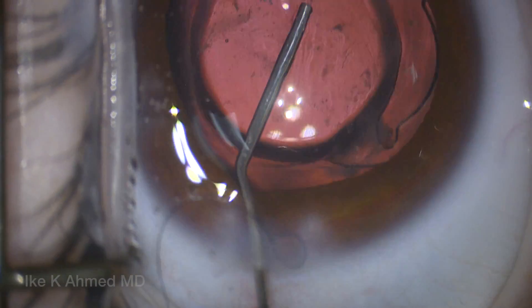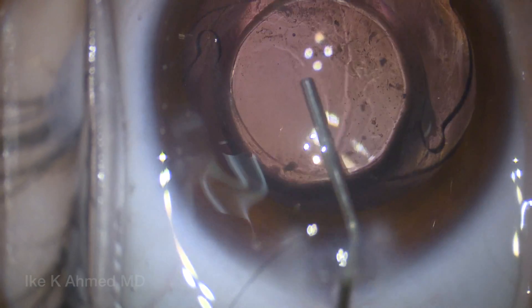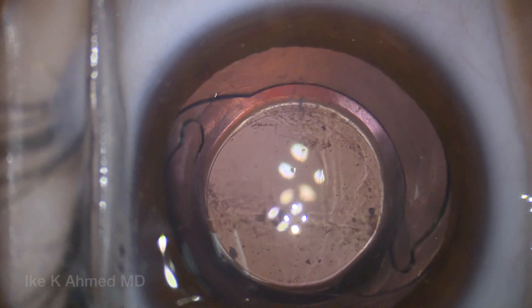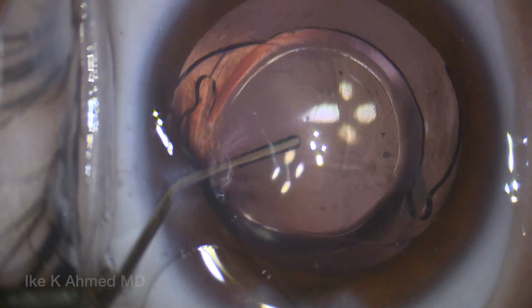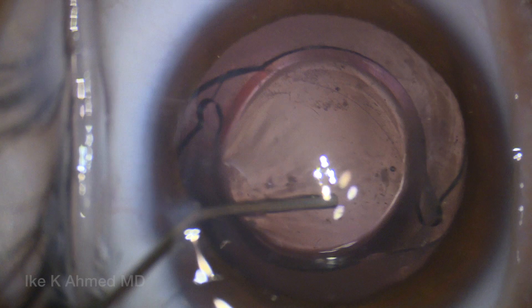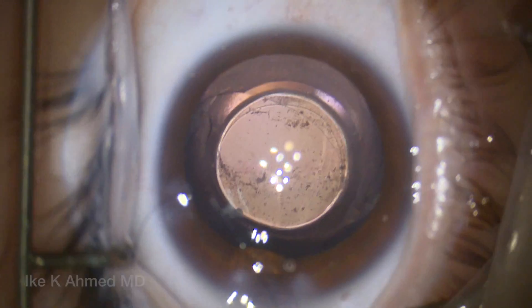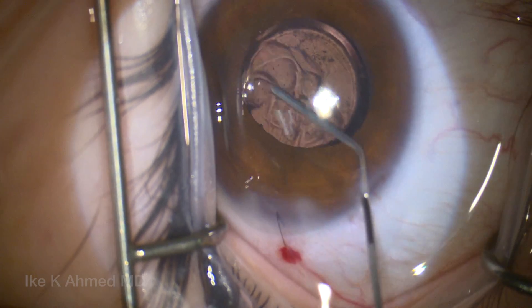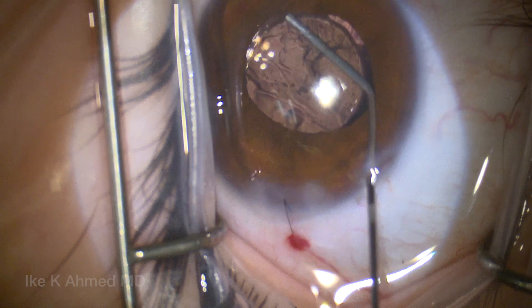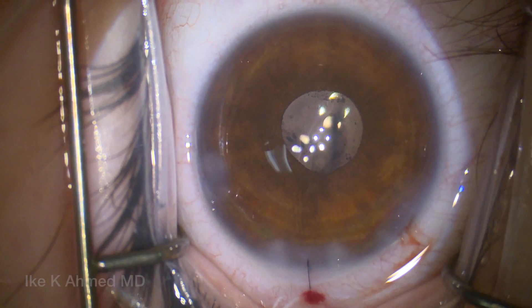We're going to prolapse the optic pole behind the posterior capsule to place that optic in a posterior optic buttonhole position. This will nicely center the lens, keep it well positioned, and keep the anterior hyaloid face away from anterior vitreous prolapse. The visual axis is quite clear, with only a few opacities present — minimal effect, very much as we might see with some asteroid hyalosis. These will dissipate over time as vitreous syneresis occurs. We've accomplished this without any vitrectomy. Note the cat's eye appearance of the posterior capsule as the haptics remain in the capsular bag while the optic sits behind the posterior capsule. We manually remove the viscoelastic to avoid vitreous prolapse, and suture the incisions to ensure adequate anterior chamber postoperatively.